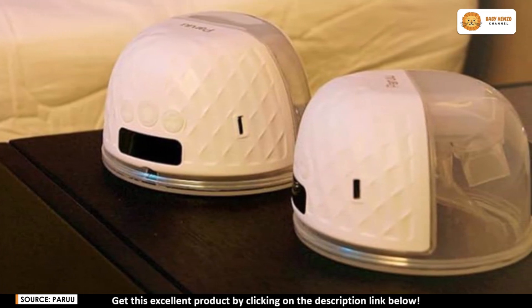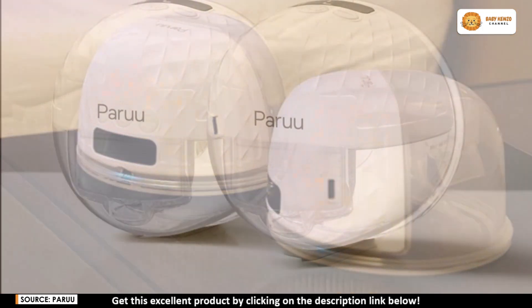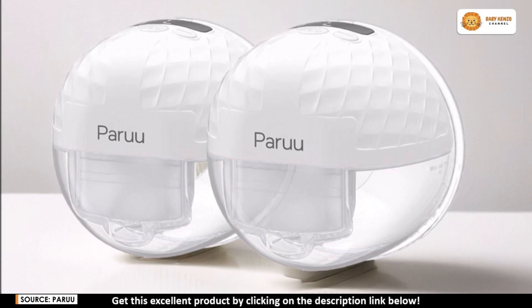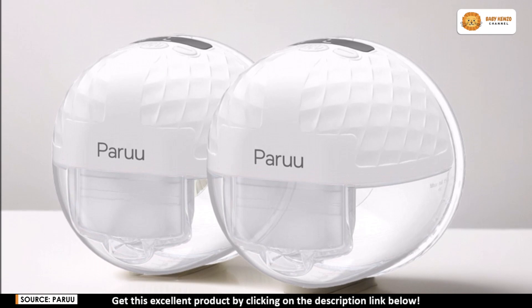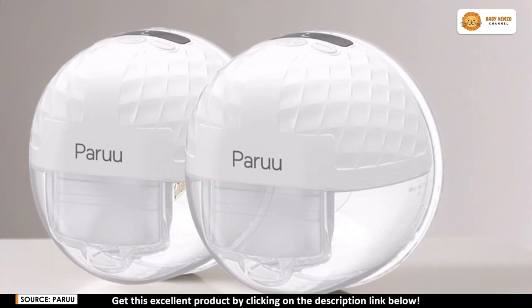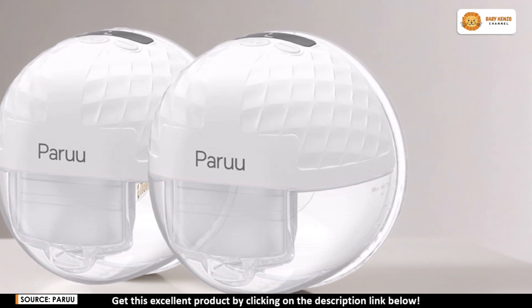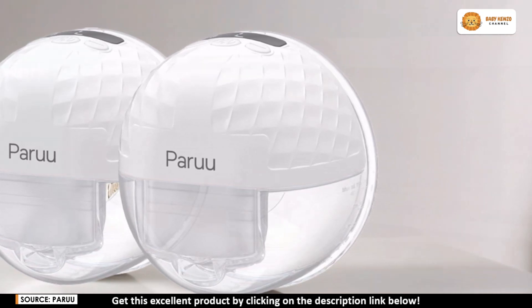The pump holds up to five ounces of milk and is best suited for collections of four ounces, making it the perfect size for most sessions. A single charge powers the Peru P10 for up to 120 minutes of pumping, giving you four to five sessions on a single two-hour charge. It even comes with a USB charging option, so whether at home or on the go, you can easily recharge anywhere. With a built-in 30-minute auto-shutdown feature, you can pump confidently without having to worry about turning it off manually.